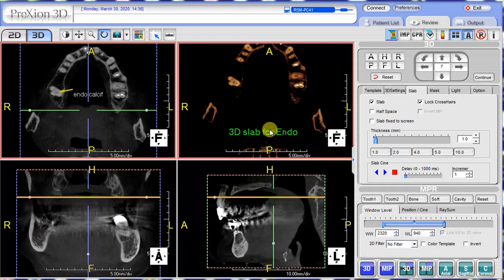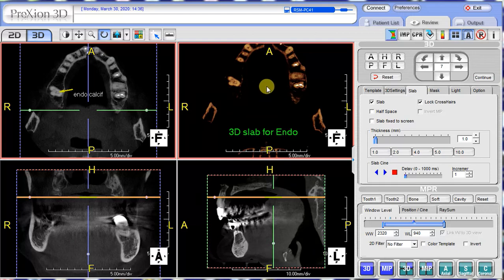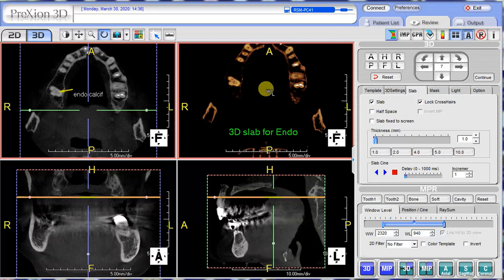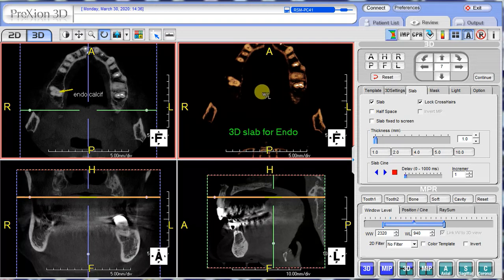If necessary, you can adjust the window level or contrast brightness by holding the right and left click together on the mouse, then moving it in a diagonal northeast to southwest direction, to get the desired level of image quality that you wish.